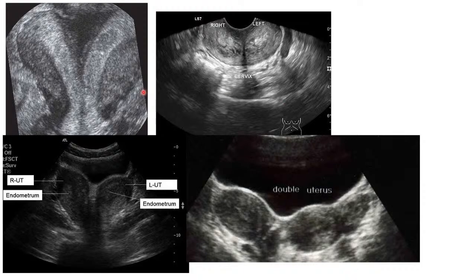So these are the sonographic findings of uterine didelphys. You can see we've got one uterus there, another uterus there, a cervix there and a cervix there, which are distinct and separate. Looking at it again, you've got the right uterus and the left uterus. So you can see here we are seeing two distinct uteruses. This is in keeping with uterine didelphys.